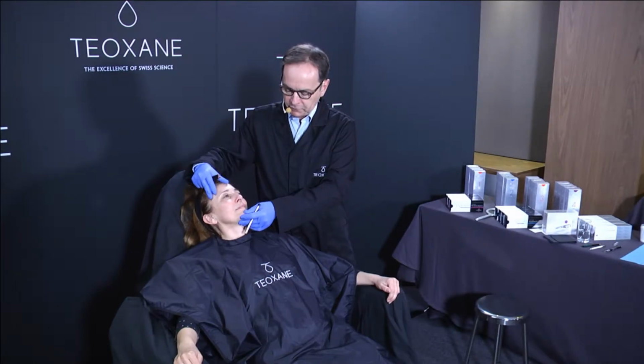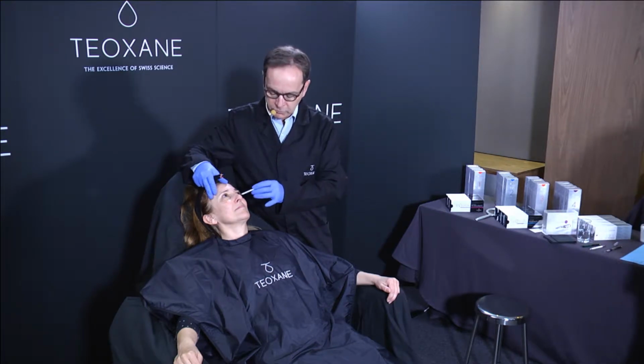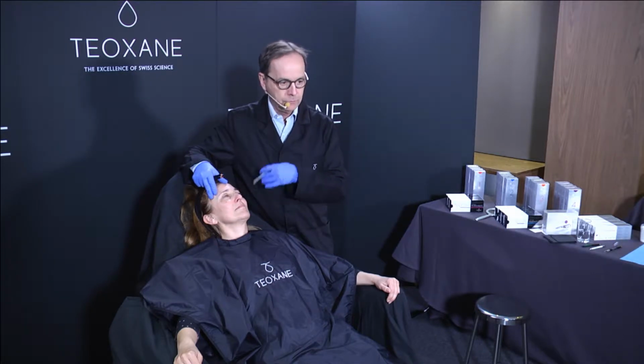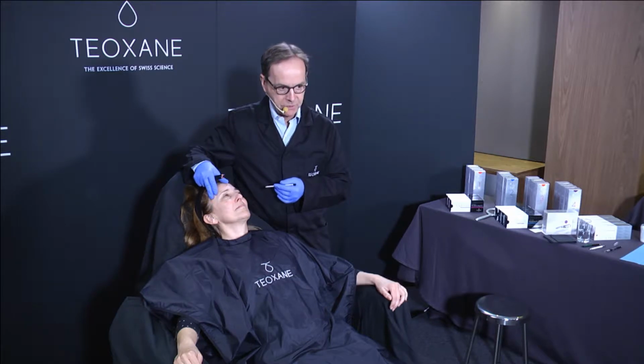So this patient is 52, and she asked me to correct the depression, the tear trough she has under the eyes. So I will not do a triple jump with a back flip on the patient and 50 syringes, but I will just do like I do in my office.